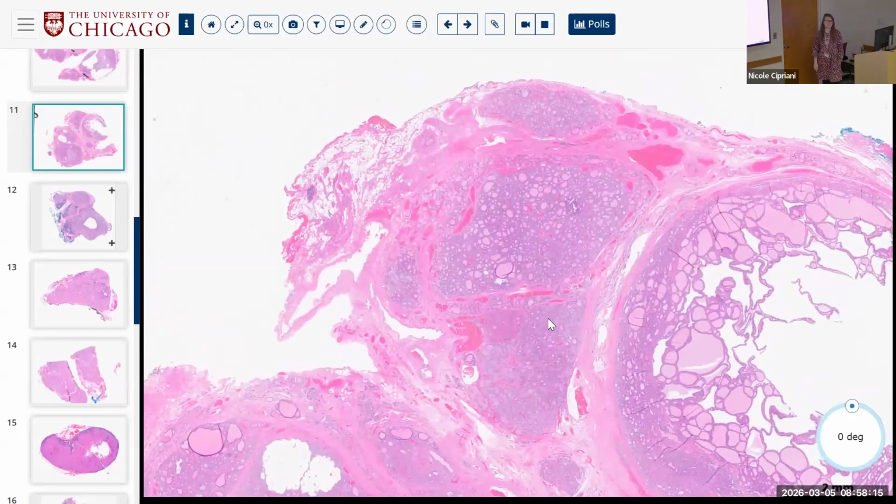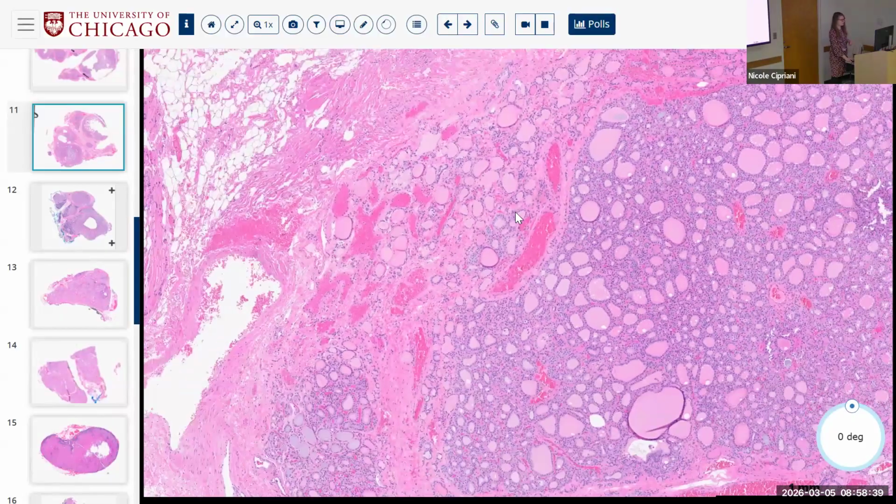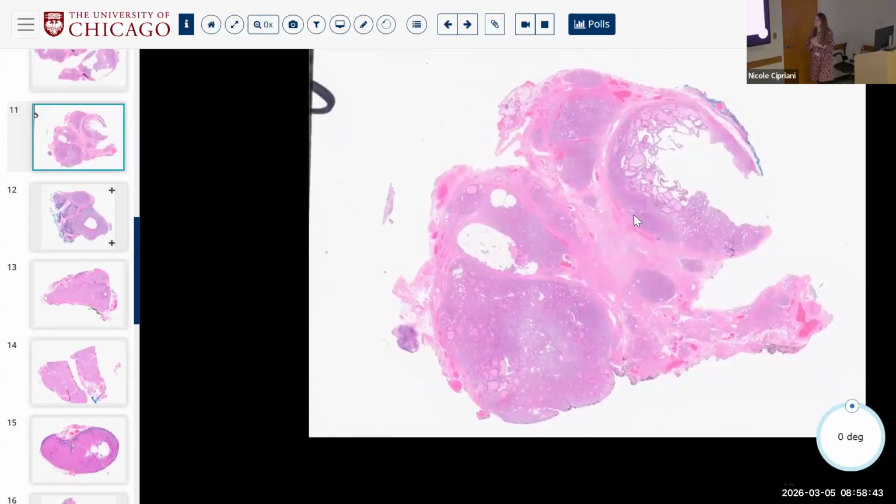Have a thyroidectomy before? No, this patient did not have a thyroidectomy before. If they did, and you saw this, then you might think about recurrent cancer, right? Or just recurrent growth of multiple nodules. But they did not have a thyroidectomy before. This is their original surgery, and there is definitely some normal thyroid in the background. So it could be regrowth of follicular nodular disease, or it could be regrowth of carcinoma, but this is their primary surgery, so it's neither of those two things.